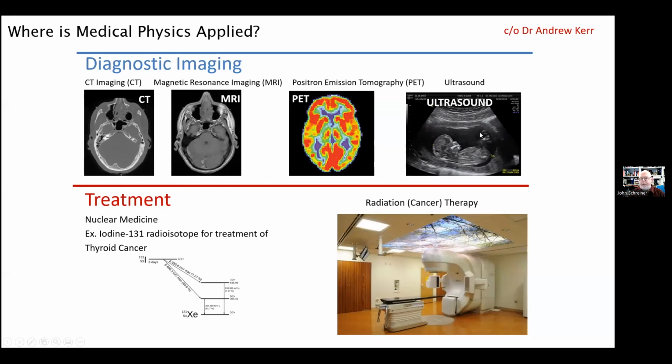All of these imaging modalities are based on the mapping of some physical parameter: attenuation coefficients, proton density and relaxation times, annihilation of positrons, sound attenuation.